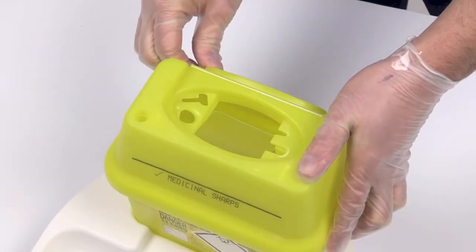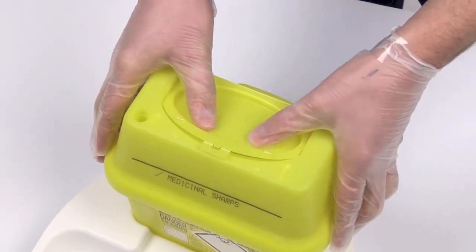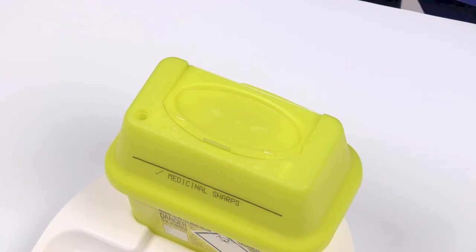To engage the temporary closure feature, release the lid from the open position, rotating the lid until it covers the aperture. Continue to close the lid until a click is heard. This indicates the temporary closure is now engaged.